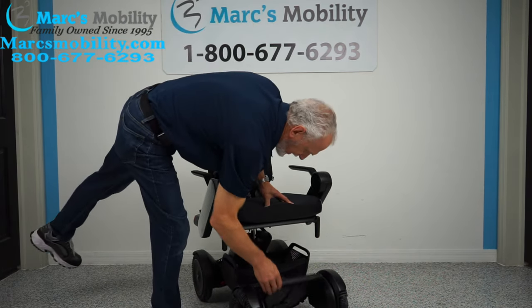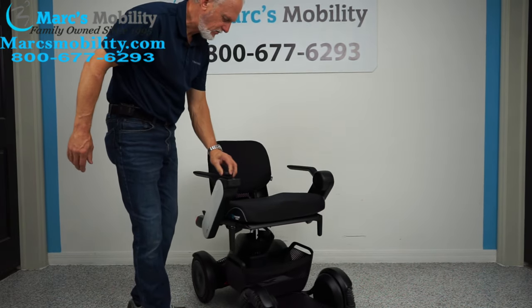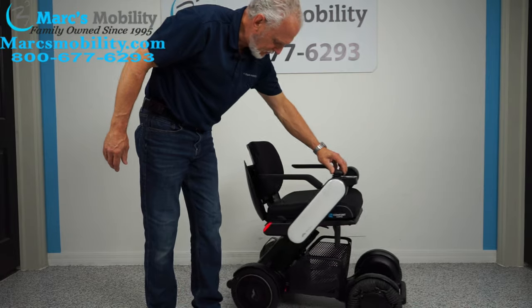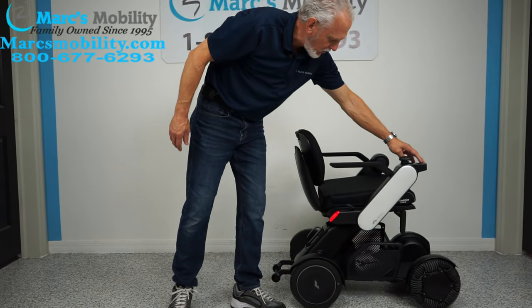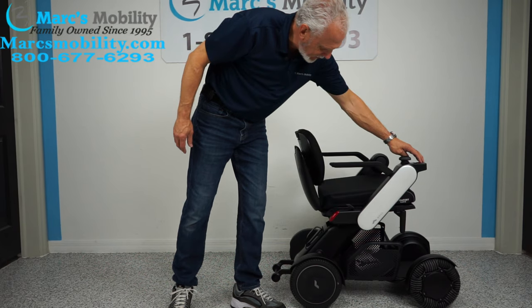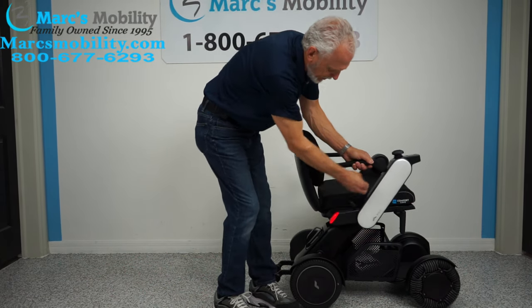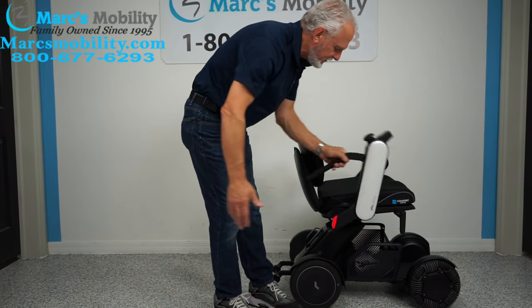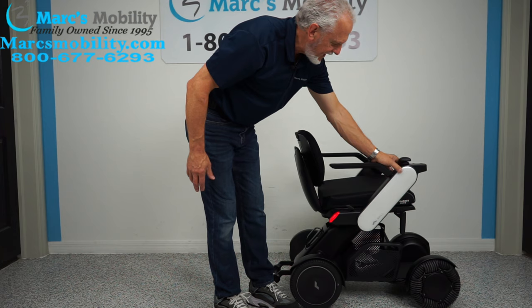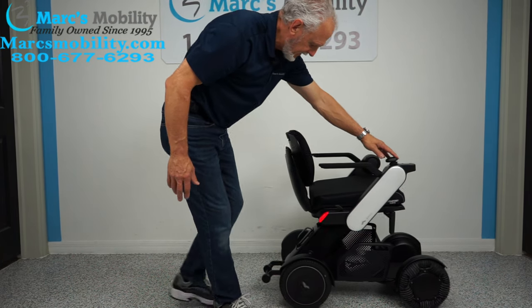The foot plate does flip up. You have lights on the armrests here — you can see them turn off and on with the power switch. The arms do flip up: pull this lever and you can slide in and out from the side. The joystick is on the right side, but it can be switched to the left side if you're left-handed.